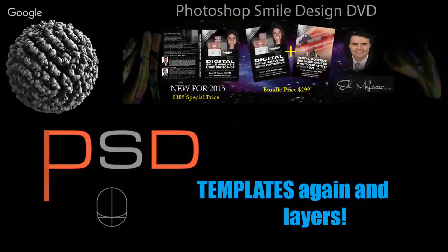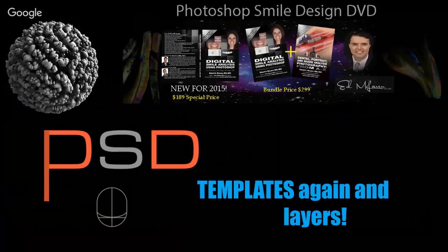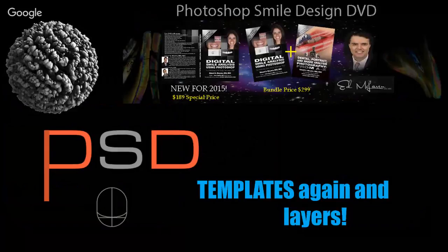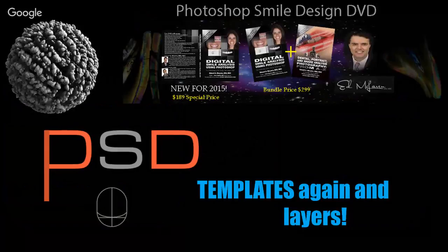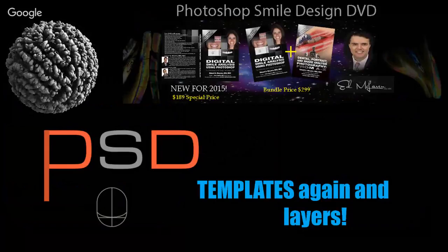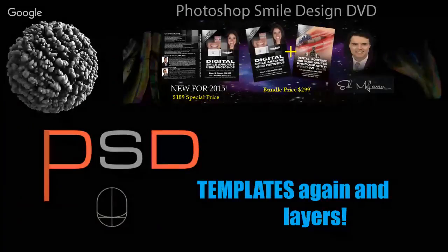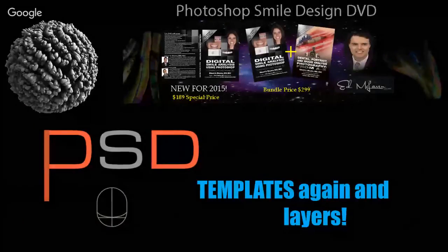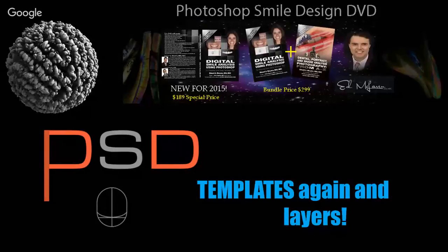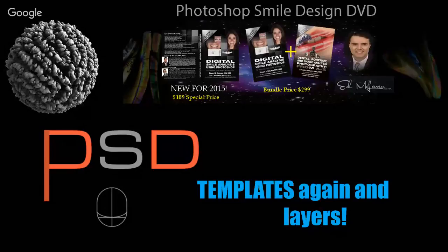With the PSD technique, we fall into the problem of using templates. For some people in Photoshop this is common. Some people do that, and others use the original texture in the teeth inside of the software to copy it and, for example, flip one central incisal to another and align it with the rest of the teeth.